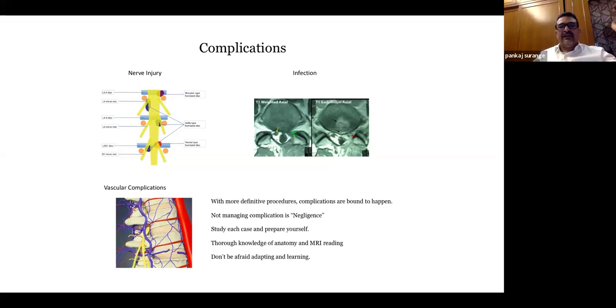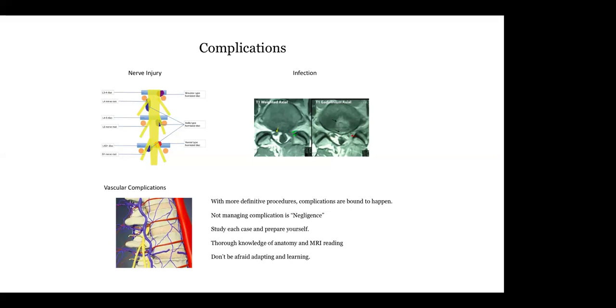So instead of drilling the iliac crest and entering the foramen, I would suggest not to do that. Better to go for the interlaminar. Sir, I differ in this opinion, if I may say.